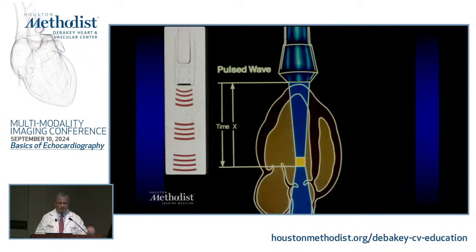Okay, pulse Doppler. What do we do in pulse Doppler? Pulse Doppler is interesting because in that field, I want to understand what the velocity is, which is frequency shift.